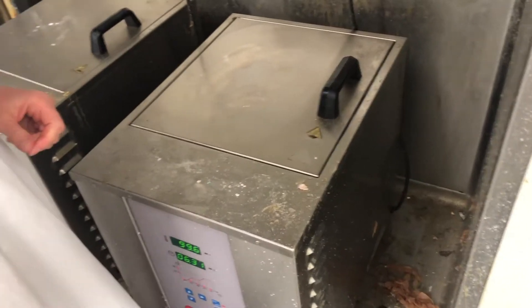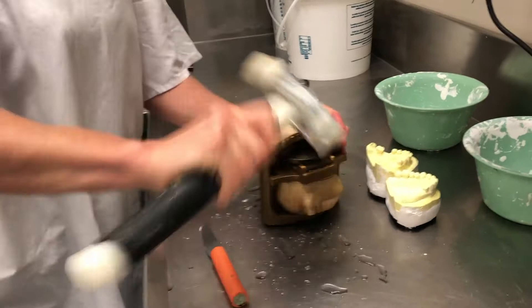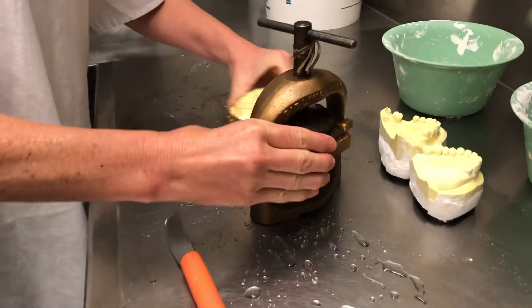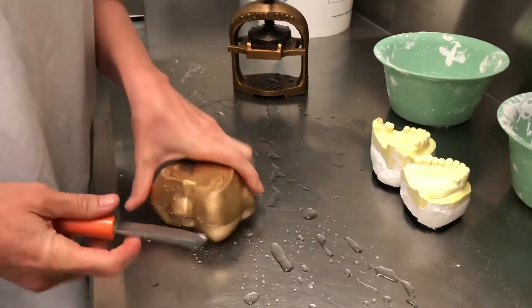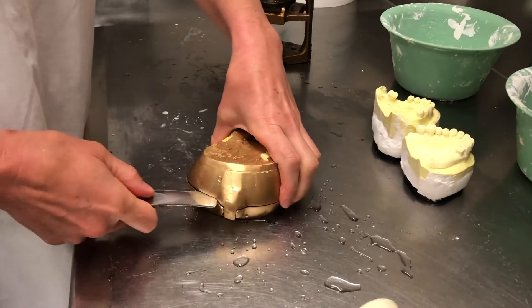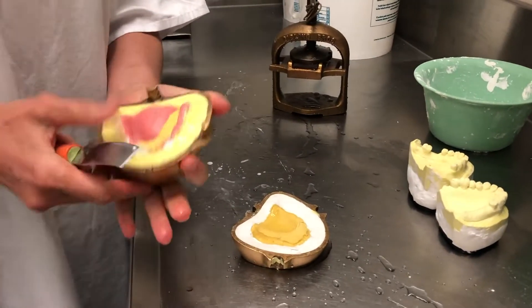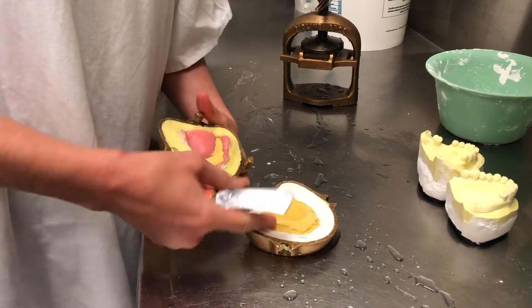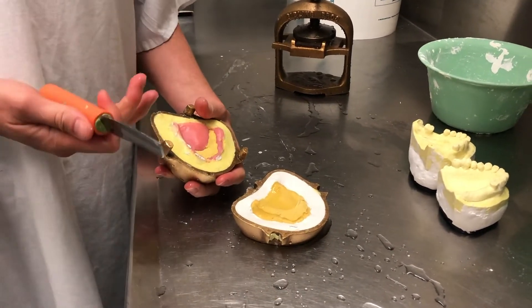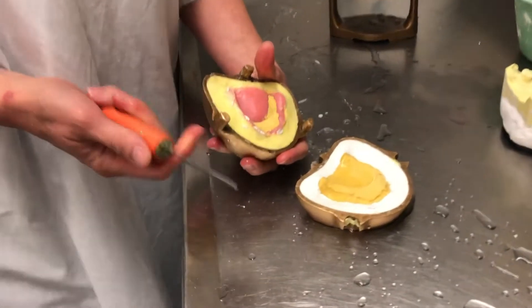Can you stack them on top of each other if you like? So sometimes you can try and get them apart. Sometimes they'll come apart in half, sometimes they'll come apart as one single thing, other times they'll break like that. This is why you always duplicate your model, because whenever you flask a job, 9.9 times out of 10, you're going to break the models.